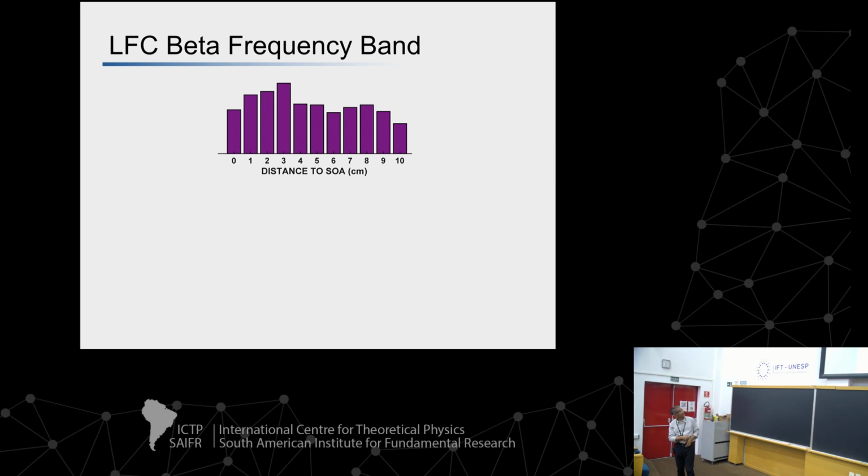The x-axis is distance to the seizure onset area in centimeters. So 0 means the seizure onset contacts, and 1 means you're 1 centimeter away from the seizure onset contact, going to 10 centimeters away. So let's say seizure onset's here, I'm stepping away from it. I've removed all aspects of anatomy other than just Euclidean distance away from the seizure onset area in centimeters. And the y-axis is my measure of connectivity. How much local connectivity do I see?